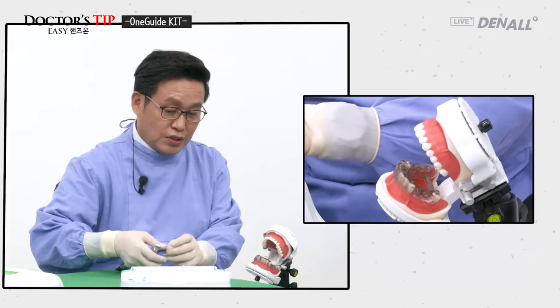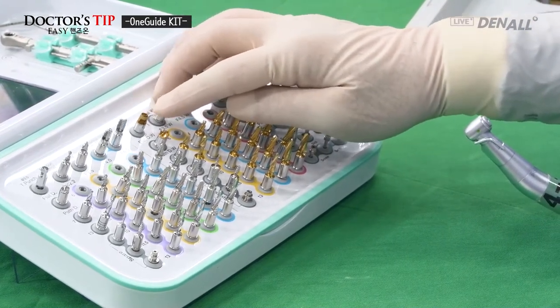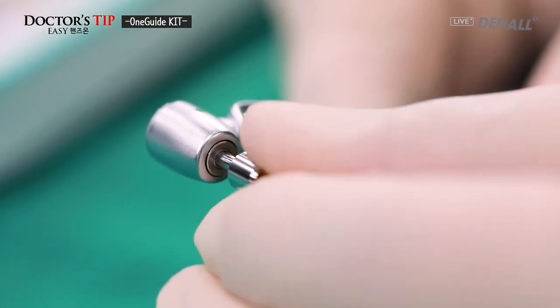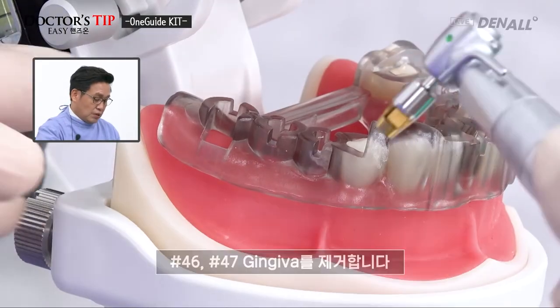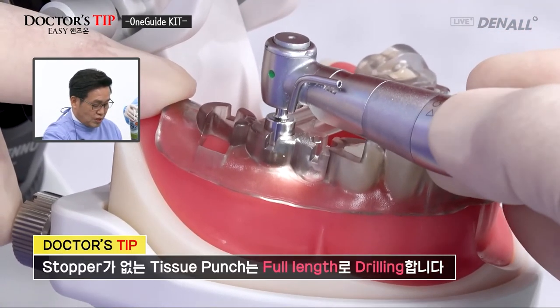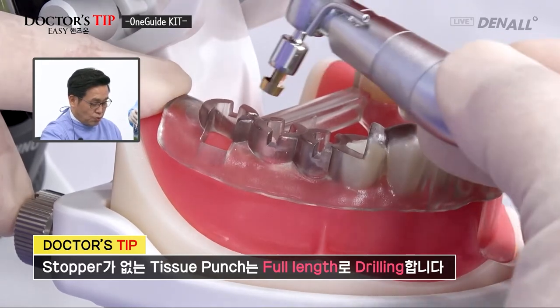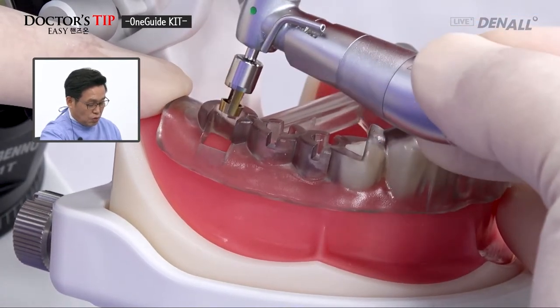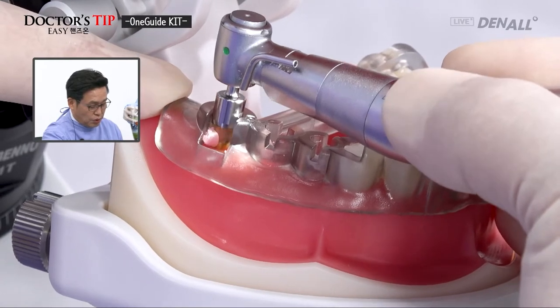Removal is done for 46 and 47. A 4.0 millimeter tissue punch is going to be used to remove gingiva in those regions. For 46, the tissue punch is connected, and if this is thoroughly done, there is no stopper, so you need to sufficiently do it to remove the tissue for the site. I have completed site 46, and for 47, this is an open type hole, so you can put it sideways, and you need to contact the lingual side for sure to do the tissue punch.